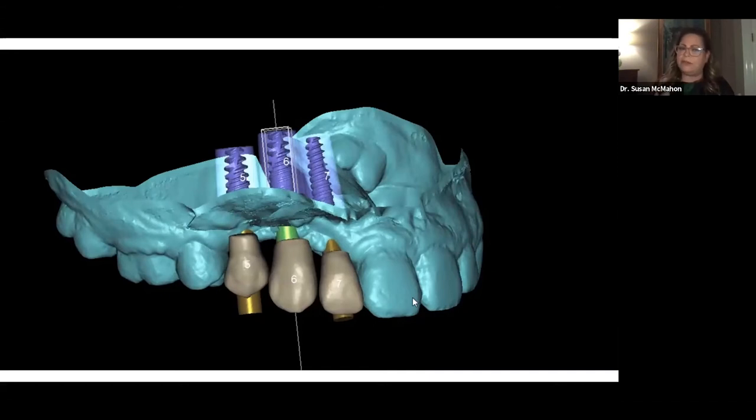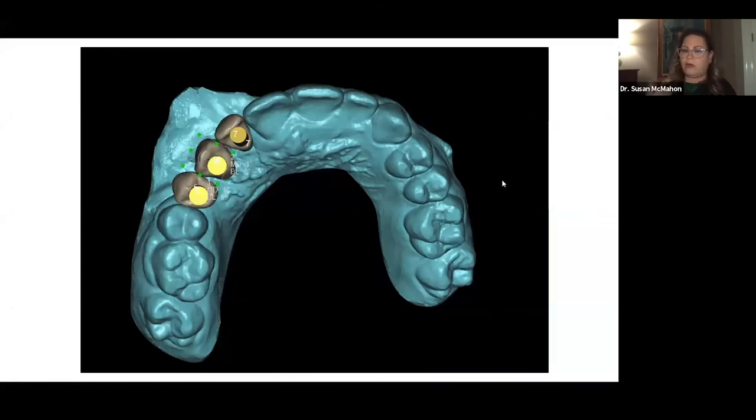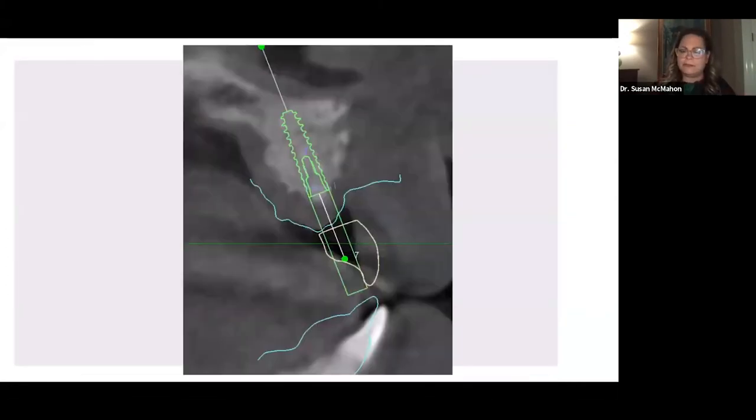And when you work as a team, you do what you're good at, which is the restorative end of things, or what I'm good at, that's the restorative end of things. And we let the other people do what they're good at. So then I know I want screw retained. So we're able to figure out exactly where the screws are going to go, if they're going to work in his bone, where the occlusion is.